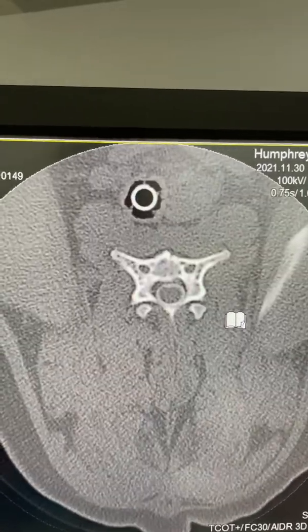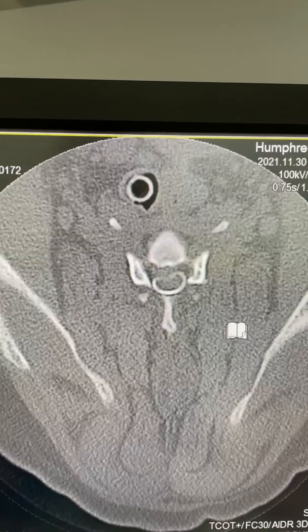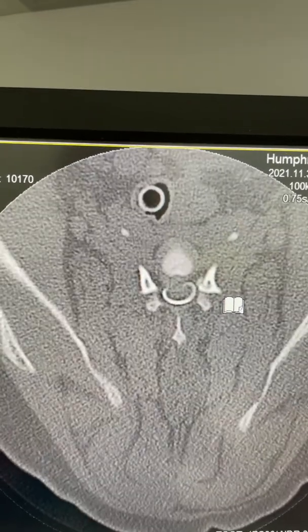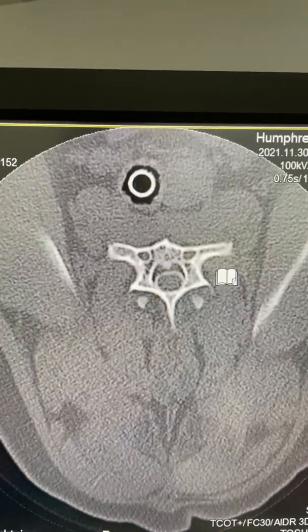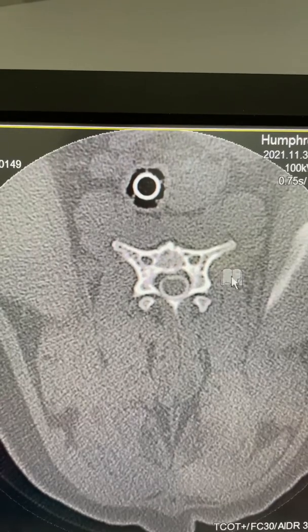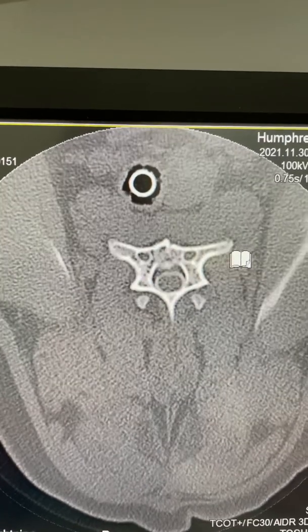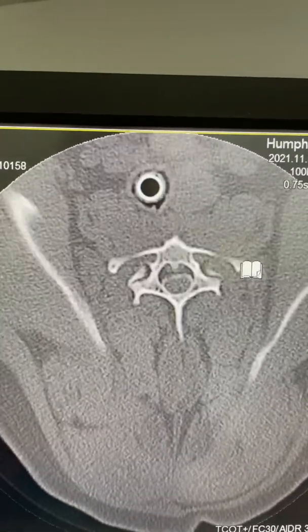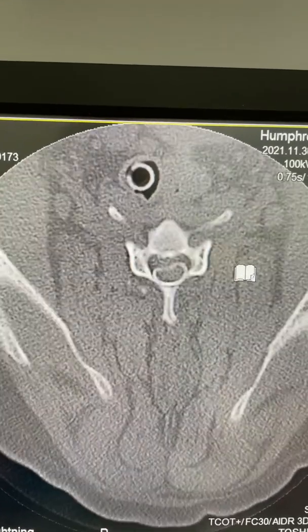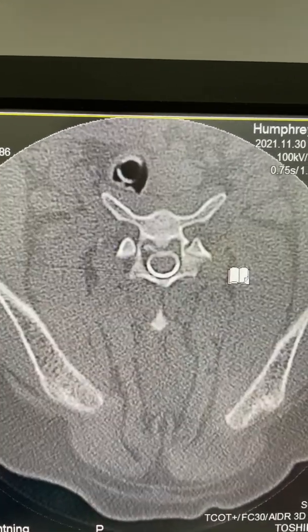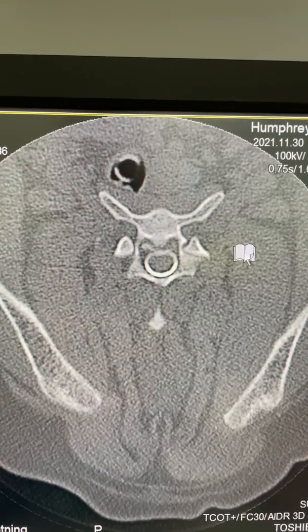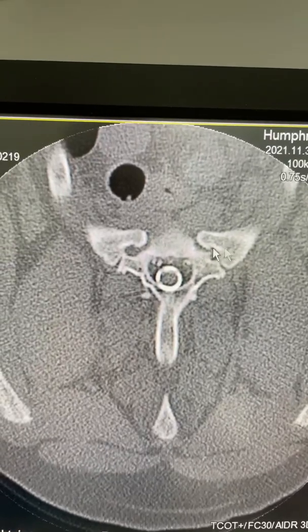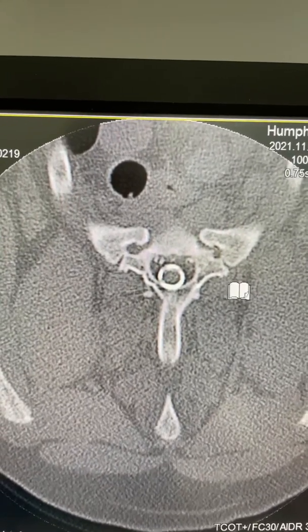Right here we see compression of the spinal cord at C5-6. We can tell that it's C6 right there because of the very prominent transverse processes — that's a very good surgical landmark we use in the OR to find out what site we're operating on. This is C5 here with smaller transverse processes, and compared to C6 here they're very prominent — you can actually palpate those percutaneously. So that is a right-sided cervical disc rupture at C5-6. That's C7 there, and then T1 — you can see the ribs coming into the first thoracic vertebra.